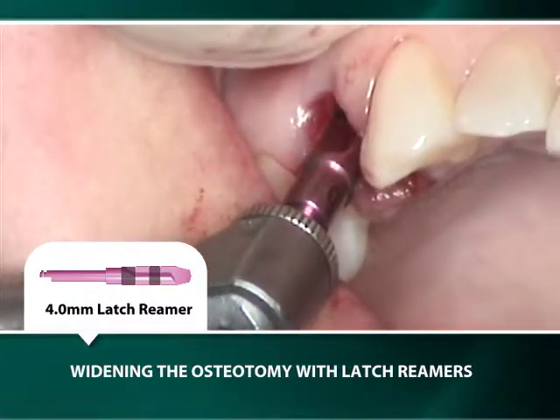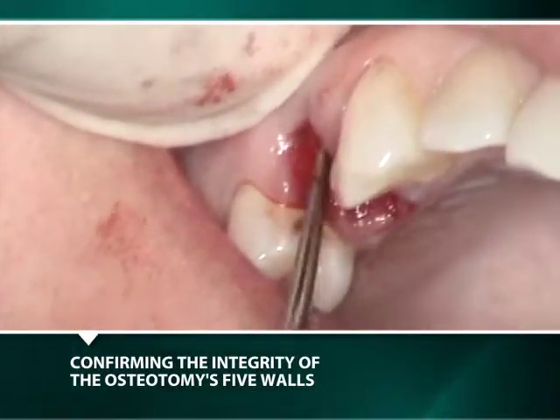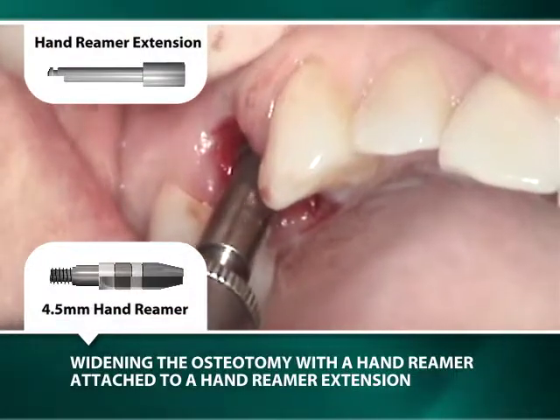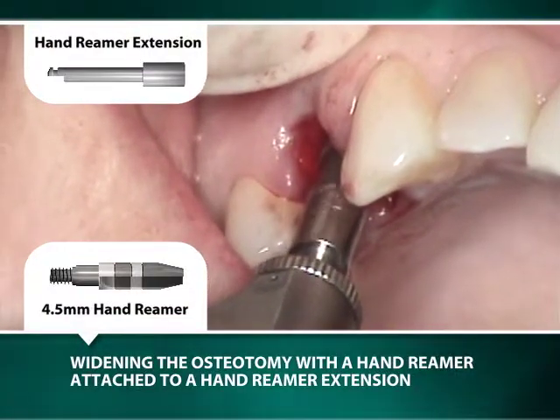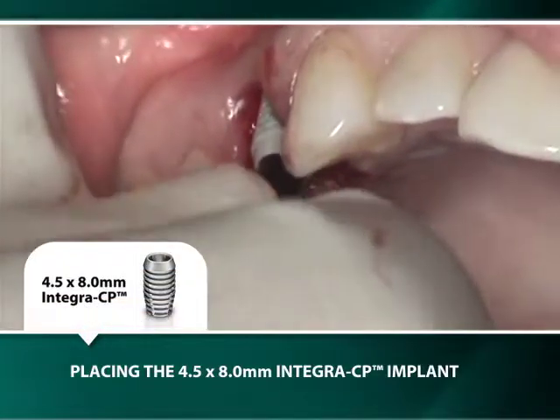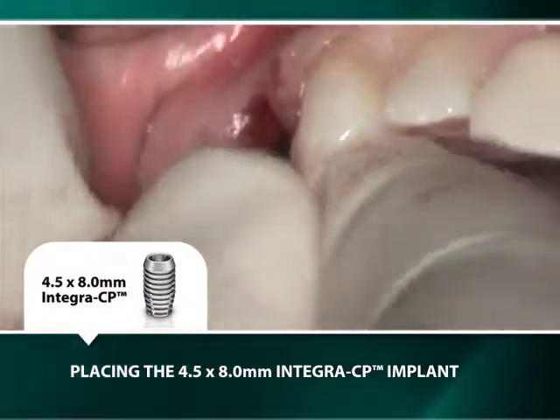After widening the osteotomy to a 4mm diameter, a curette is used to remove any bony fragments. A final width of 4.5mm is achieved prior to transporting and inserting the 4.5mm by 8mm Integra CP implant into its osteotomy with its black healing plug.